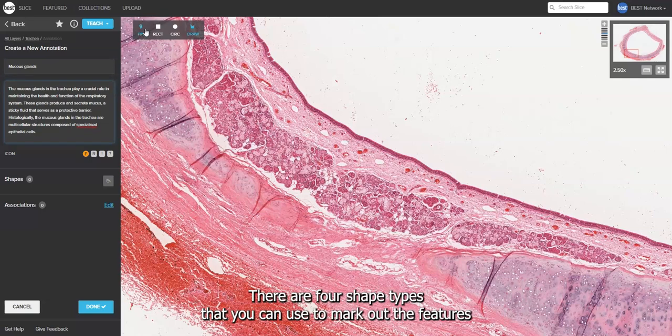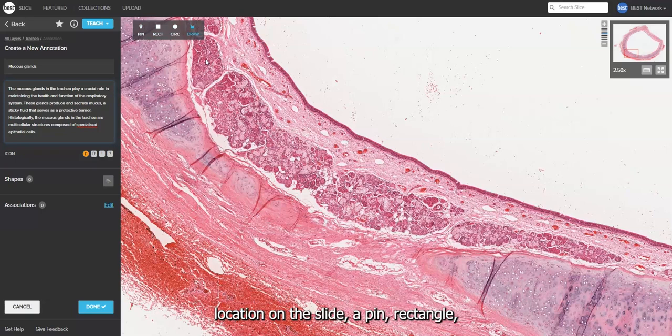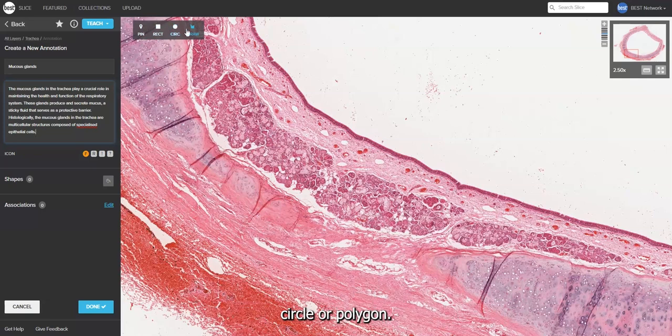There are four shape types that you can use to mark out the feature's location on the slide: a pin, rectangle, circle, or polygon.